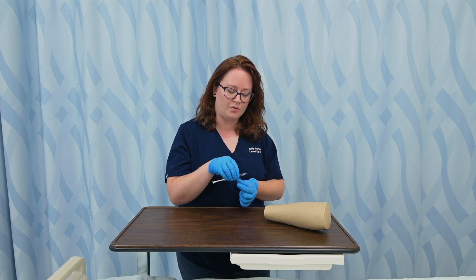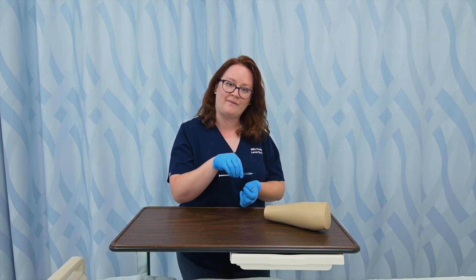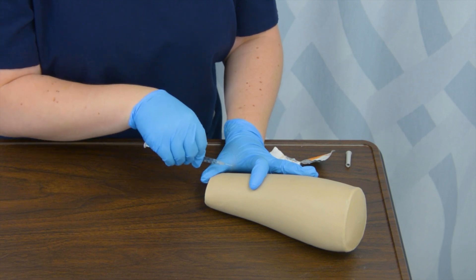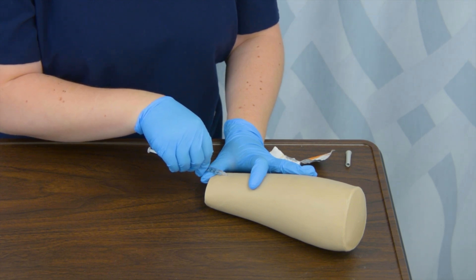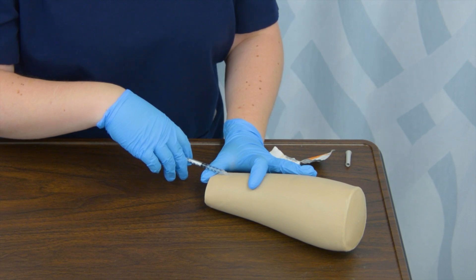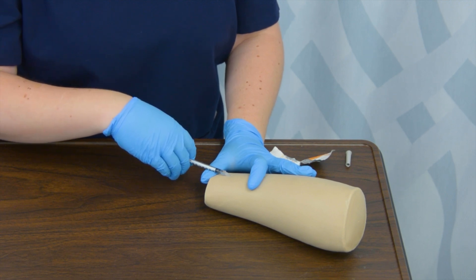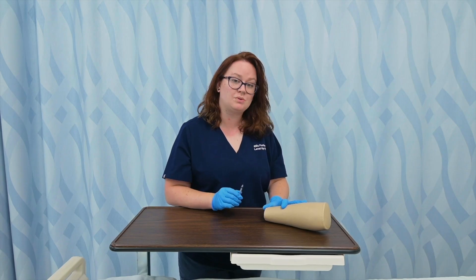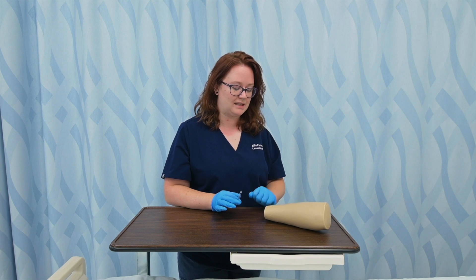With my bevel up and my hands kind of high on the syringe, I don't want to grip it really low or hold it like a dart like I would for an IM. I want to hold it rather high because I need to go at a really low angle and I don't want my fingers in the way. I'm going to pull the skin taut with my thumb and forefinger of my non-dominant hand, holding my syringe with fingers on top, bevel up, and inject at a 5 to 15 degree angle slightly under that skin. Once the full bevel is under the skin, I inject the medication hoping for that bleb to form. I then withdraw it at the same angle, and it's imperative that I do not massage the site, because that might disperse the medication into different layers of tissue.